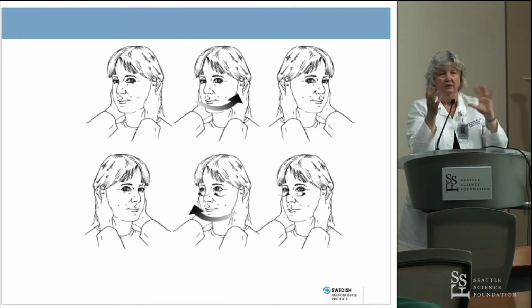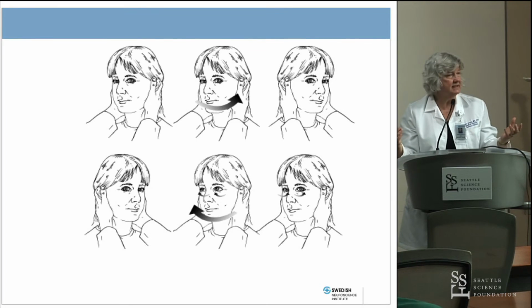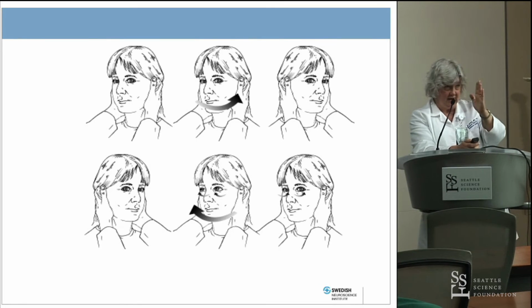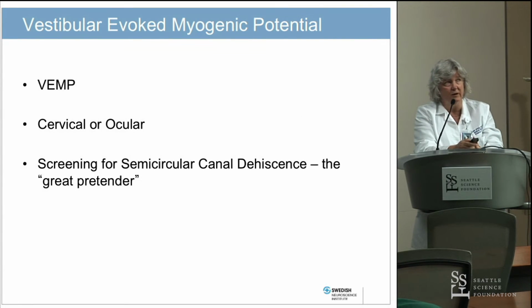So this is a good check, like if you're in the hospital, the patient got gentamicin, they're dizzy. Do they have a functioning vestibular system? Just bedside head thrust testing can be very helpful in seeing whether they can stay focused on your nose. No special equipment needed. But again, the new computerized systems will give you a little more information.